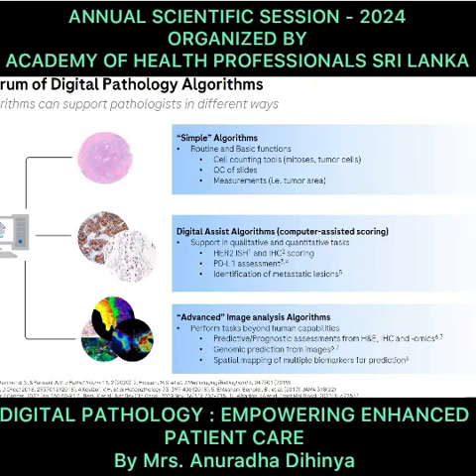What this algorithm helps with, especially for heterogeneous cases, is a heat map, so you can focus on those areas and it helps the pathologist. It says, okay, this is the area we need to look into and score. Similarly, there are many advancements happening in algorithm development.